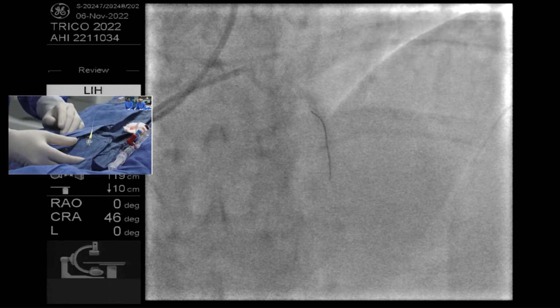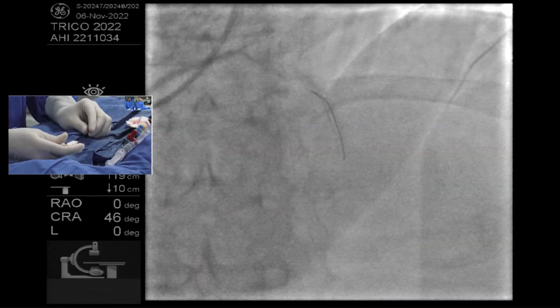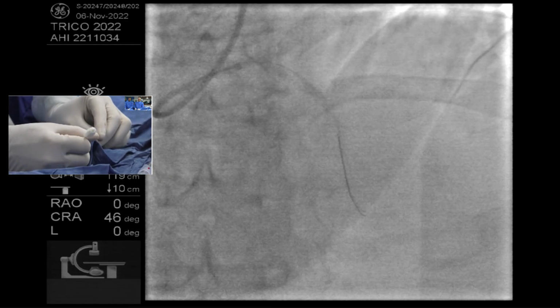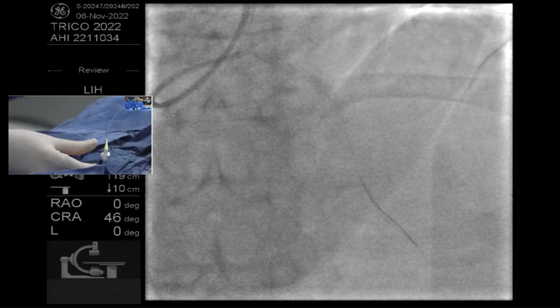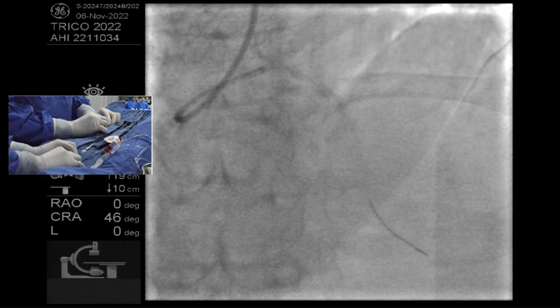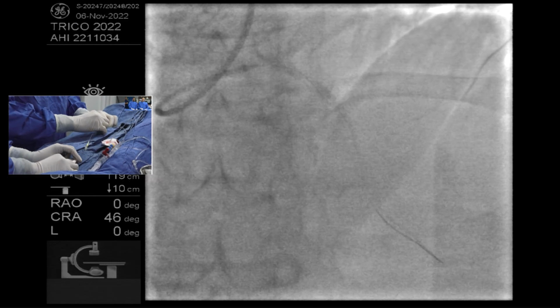Microcatheter. Yeah, of the wire. What burr are you going to start with? This is 1.5. 1.25. This will be 1.5. You should do a lot of ablation because there is a step in there. Yeah, that's right.